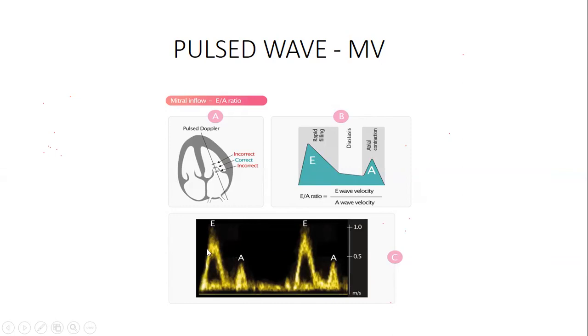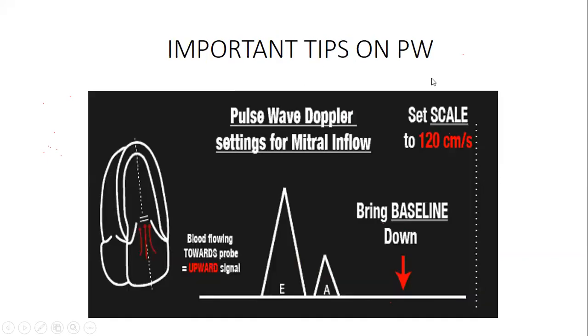Remember, it also looks like the M, okay? Like the one we had on the M mode on the mitral valve. It looks like the M. So it should not confuse us. This is still a tip that I just wanted to show.